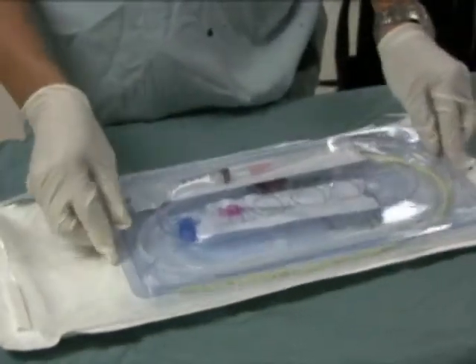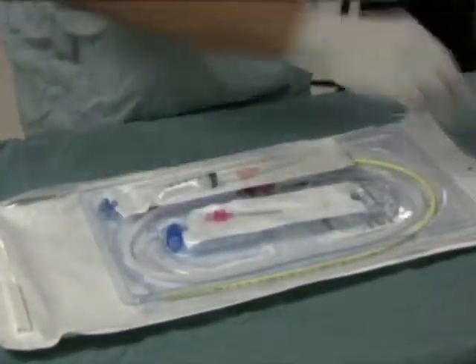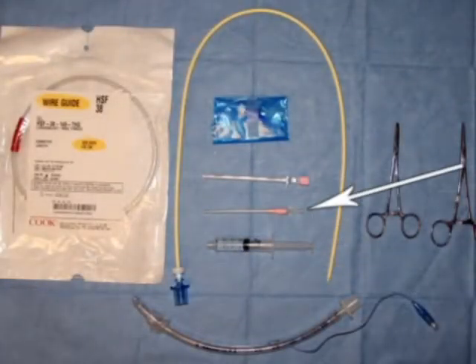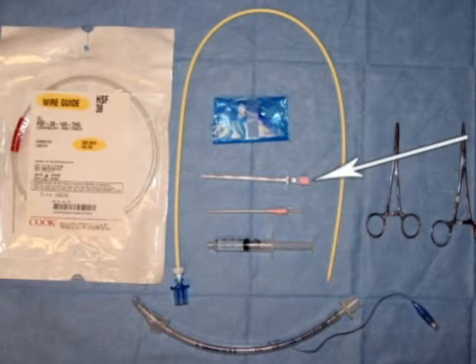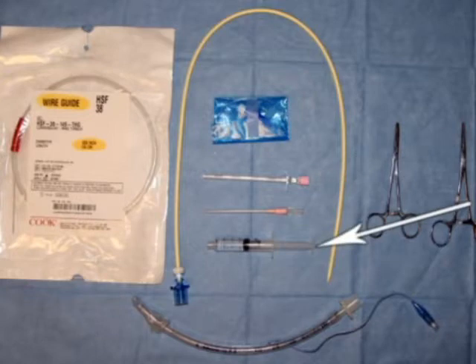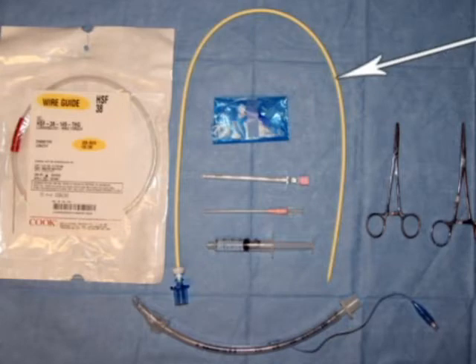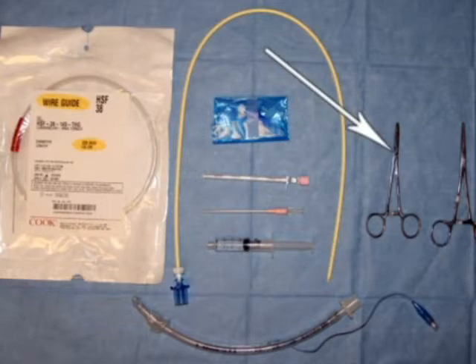A pre-assembled, purpose-designed kit is commercially available. To perform a retrograde intubation, the following essential equipment is required: an 18-gauge needle or intravenous angiocath, a 17-gauge Tuohy needle, a 5-milliliter fluid-filled syringe, a guide wire or an epidural catheter, a tapered antegrade guide catheter required for the guide wire technique, an appropriately sized tracheal tube, and two hemostats.